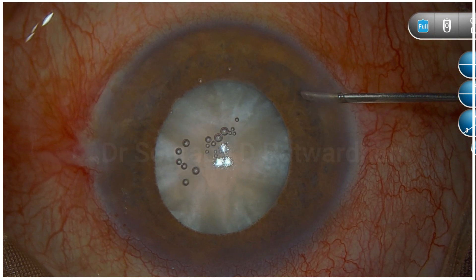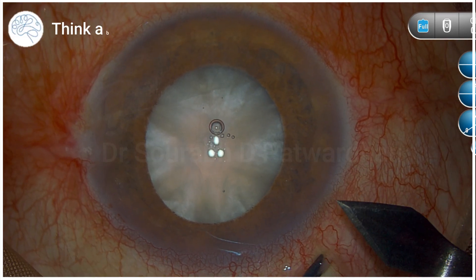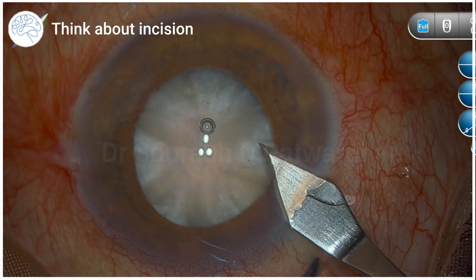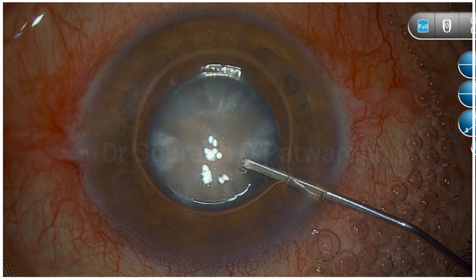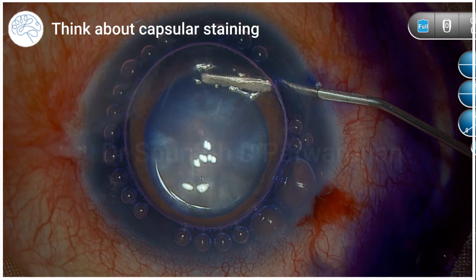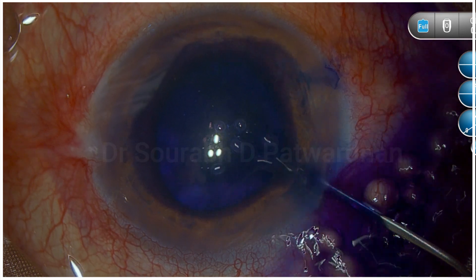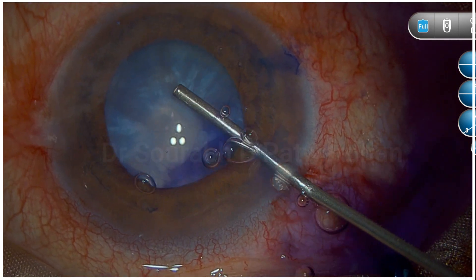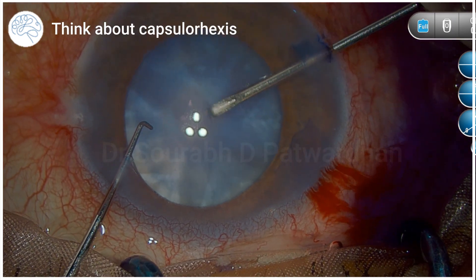The most important thing while doing any case is to understand it's stepwise. If you are doing the incision, always think about the incision — make sure it's the correct length. When you enter, make sure there is no aqueous leak. When staining the capsule, this is a very intumescent white cataract; this patient had phacomorphic glaucoma, now controlled. The surgeon stained the anterior capsule, waited for some time so it takes up the stain, and also injected some dye under the iris.